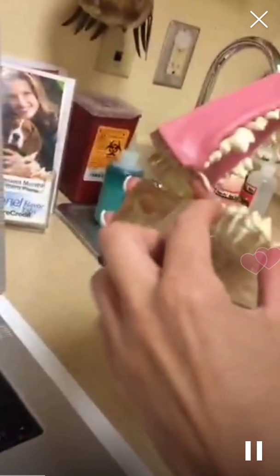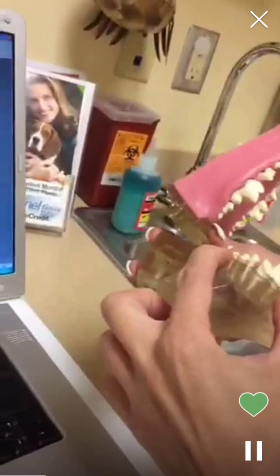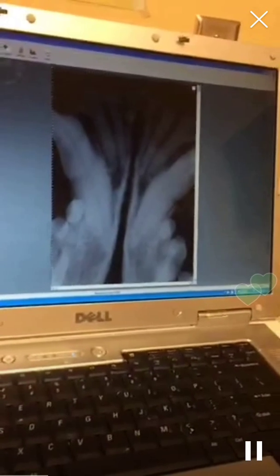So major pathology going on in the right arcade, and we had to extract this whole arcade here. So 1, 2, 3, and 4. And then now we go to the lower jaw. And now we're looking at it like this. So the incisors here, canines here. She has interesting canines.